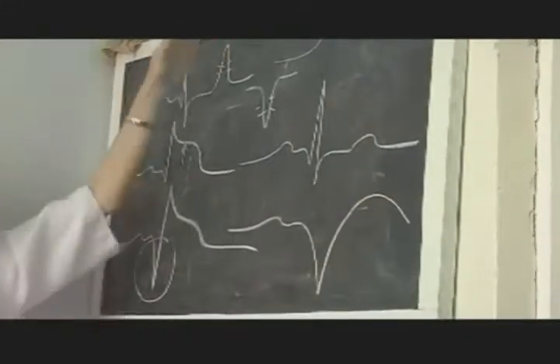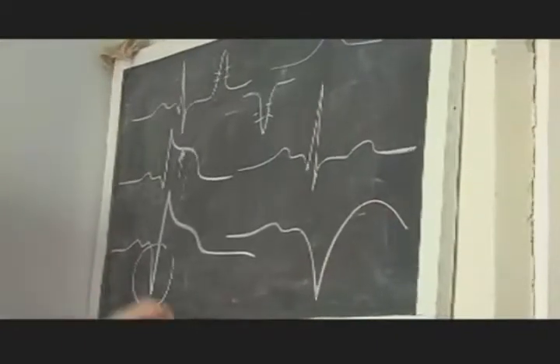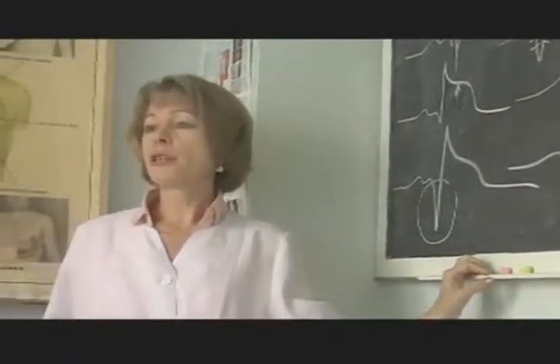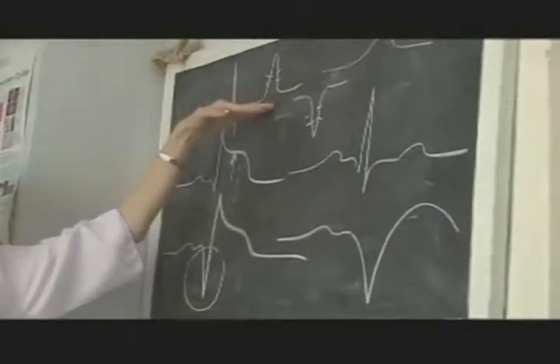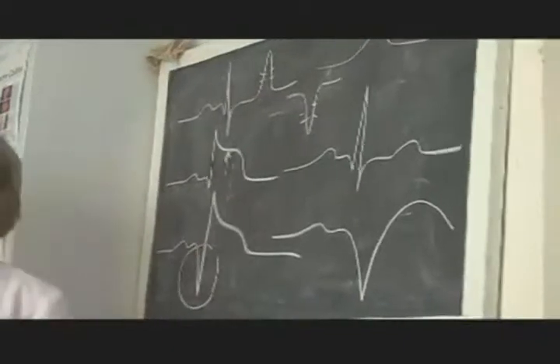Because during the acute period of myocardial infarction, all pathological processes will be present: ischemia, damage and necrosis. It all depends on what time the ECG was registered. If the ECG is registered 40 minutes after the attack of pain, we can reveal only ischemia. After 2-3 hours there will be damage. After 6 hours there will be necrosis.